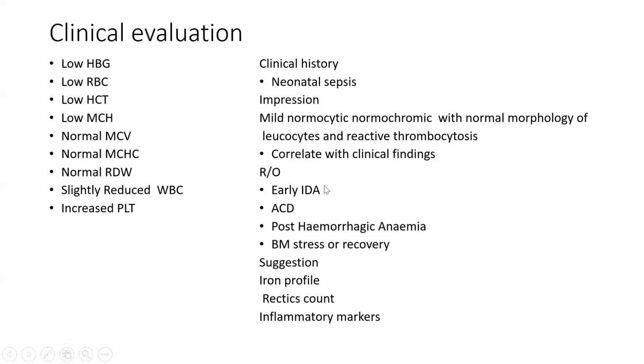If we examine a film and it is abundant in platelets, and we are seeing small platelets, it is as a result of a certain reaction coming. So after examining the film, it will give us the idea as to all the things that Doc has spoken about, the iron profiles, the CRPs, etc.